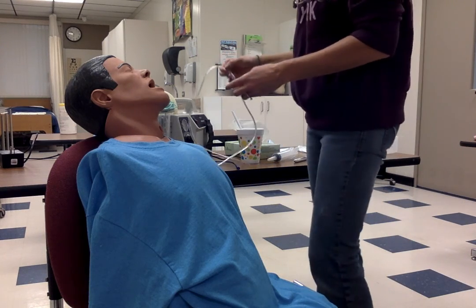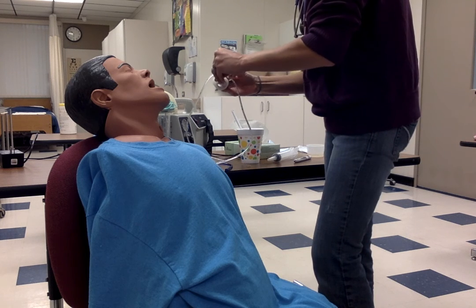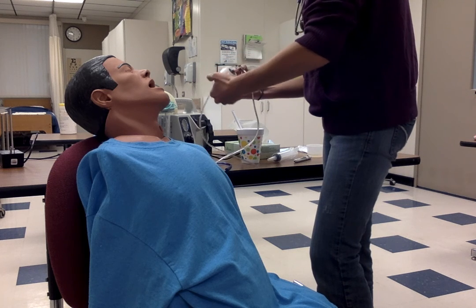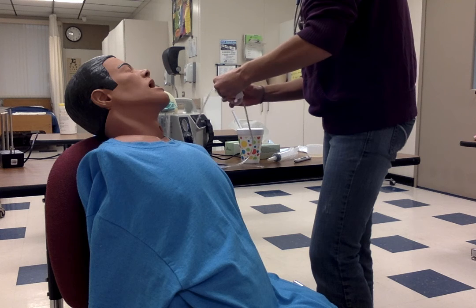So for demonstration, or for my purpose, I am going to go ahead and mark this with some tape because once I'm inserting, I don't want to put this too far in.